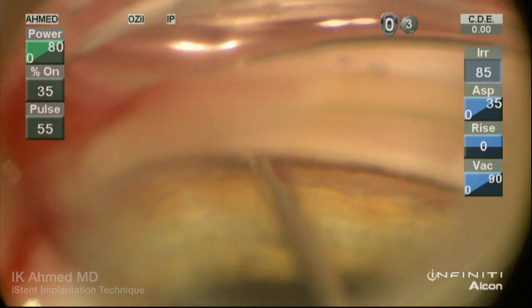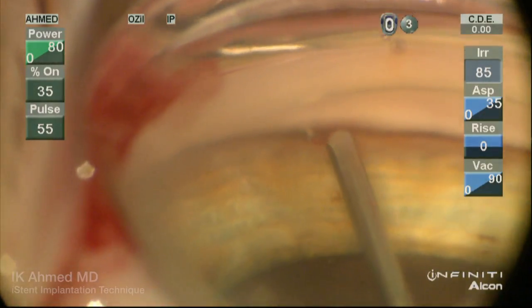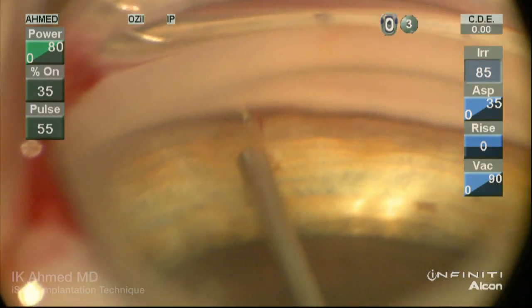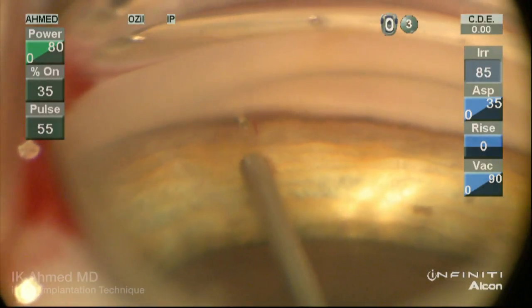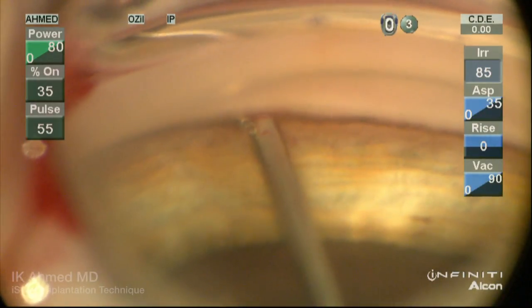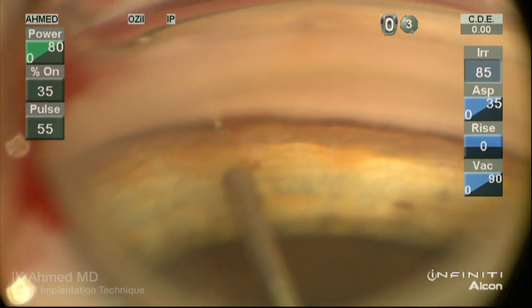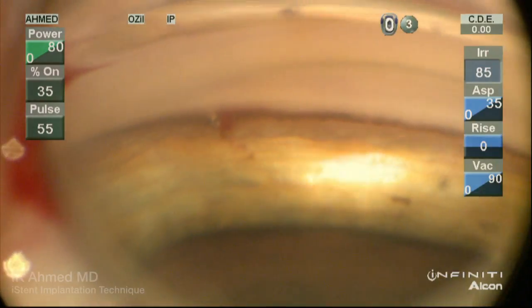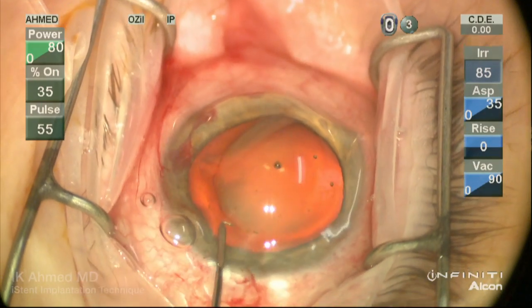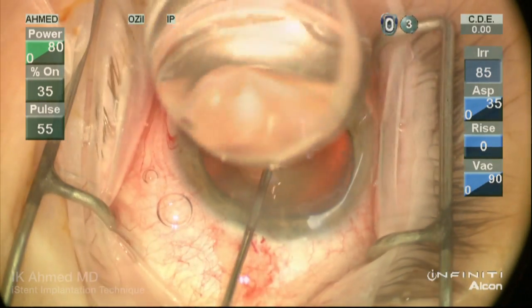The snorkel end is then released gently, and we then observe the position of the snorkel within the inner wall itself. Tapping on the implant to push it against the canal, as well as pushing the snorkel end against the outer wall, ensure adequate placement. It is quite normal and expected to see some blood reflux emanating from the insertion and from the snorkel end itself.